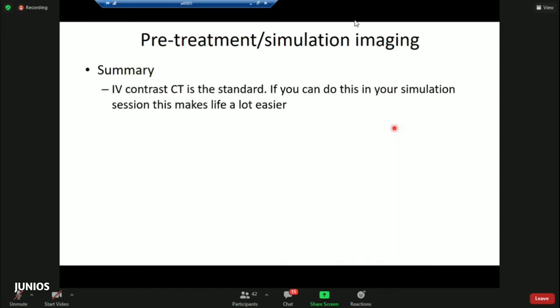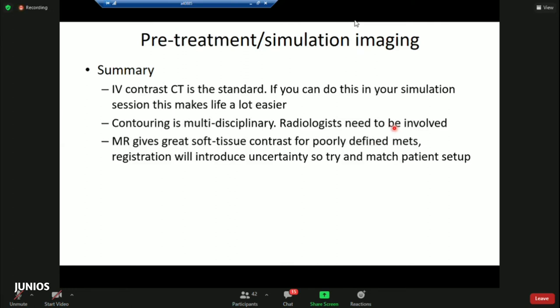So as a summary, with IV contrast we always aim to acquire without motion blurring, which means breathhold at any level, ideally exhale, or if the patient cannot do any level of breathhold, a steady liver motion phase. We want steady liver motion acquisition with IV contrast, which can be used for accurate target delineation. The contouring, fusion and motion management process is an MDT approach, so we really add value there. But all the other secondary images are for guidance and diagnosis purposes only in our department.